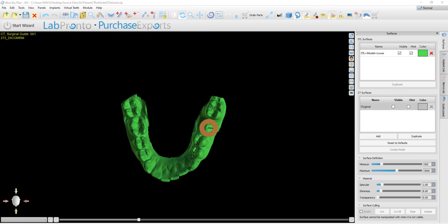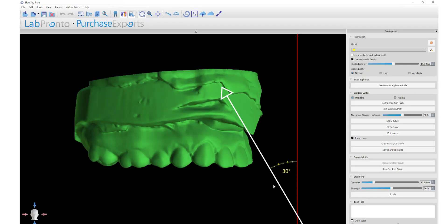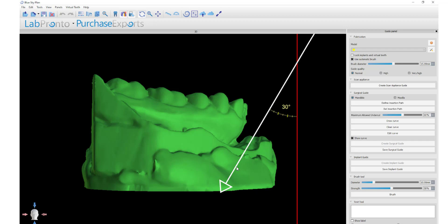In the recent update, we allow the user, if they would like, to control the angulation of the path of insertion, and we display the model with the undercuts removed on screen for easier visualization and understanding. If the user does not want to customize the path of insertion, by default we remove undercuts at a 30-degree angle, as we can see on the screen for the maxilla and now for the mandible.